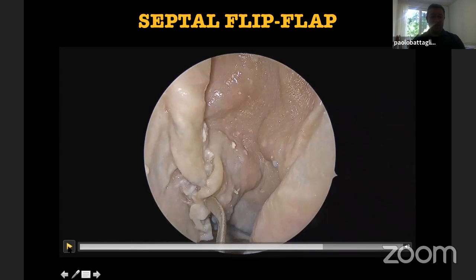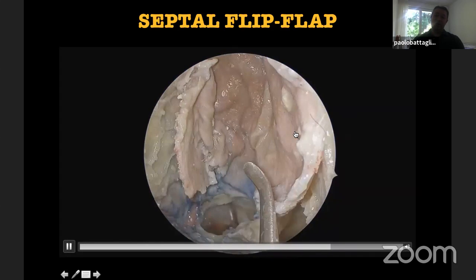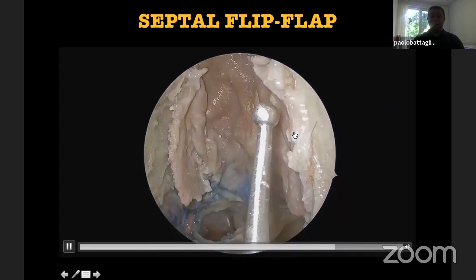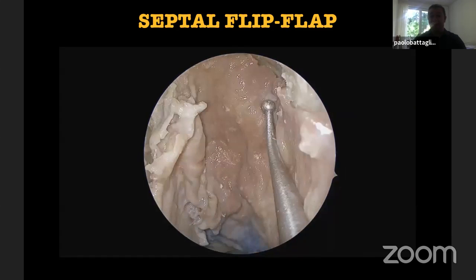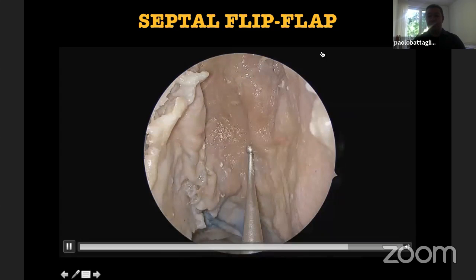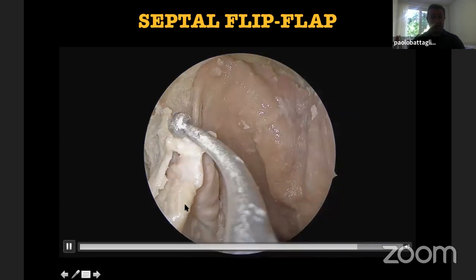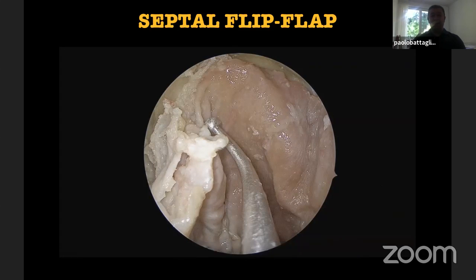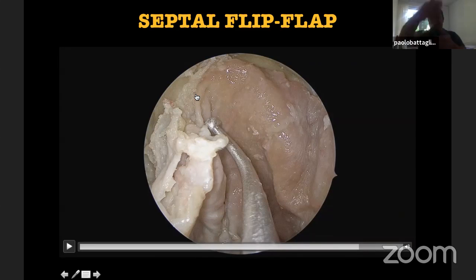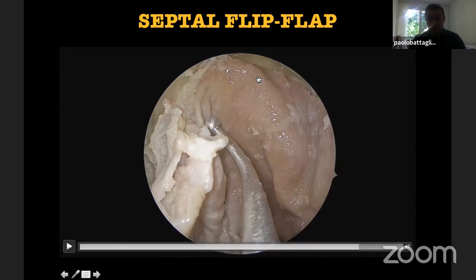As you can see, the flap, if you extend it at the level of the nasal floor, can also cover the orbit over here. It's very frequent that a tumor is attached and pushed at the level of the papyracea. So it's very frequent that we remove the papyracea, leaving the periorbita or removing the periorbita also. In such a way, this flap can cover the anterior cranial base and also the medial part of the orbit with the fat that sometimes is exposed. As I told you before, if you extend your anterior incision superiorly and anteriorly, when you turn this flap, it can cover this area also.